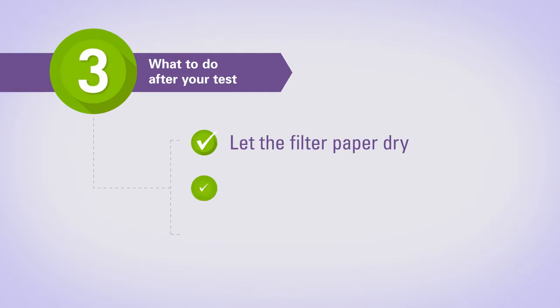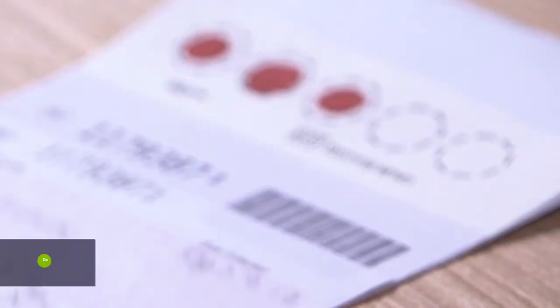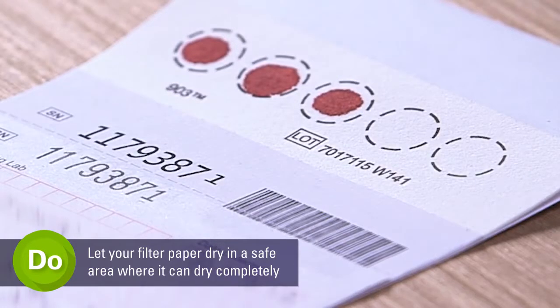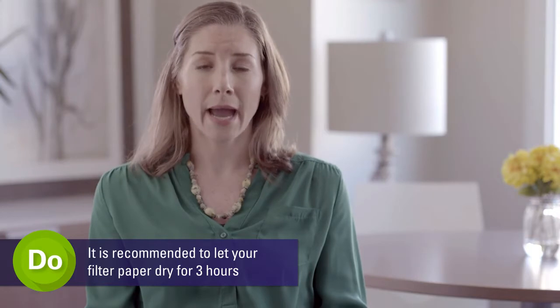Now that you have completed your test, it is important to let the filter paper dry in a safe area where it can dry completely without becoming contaminated or soaked through to another surface. It is recommended that you allow your filter paper to dry for three hours.